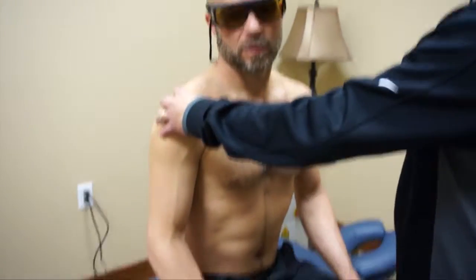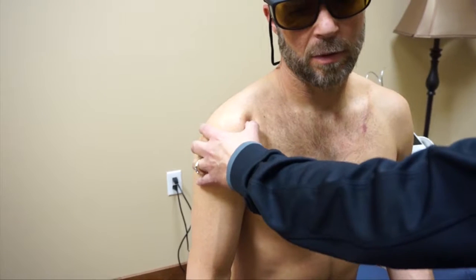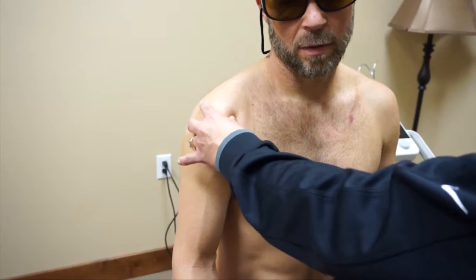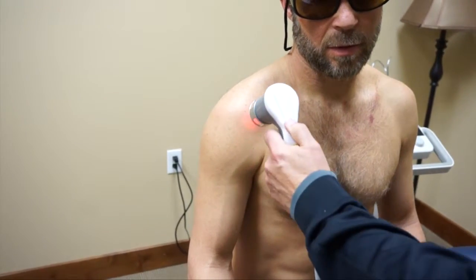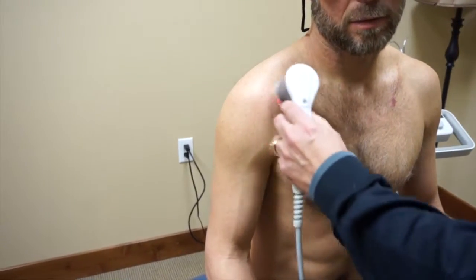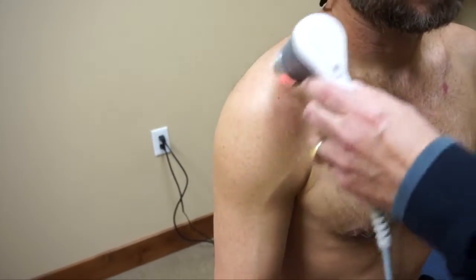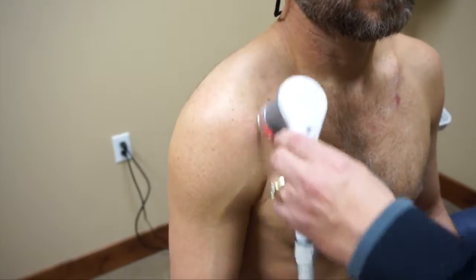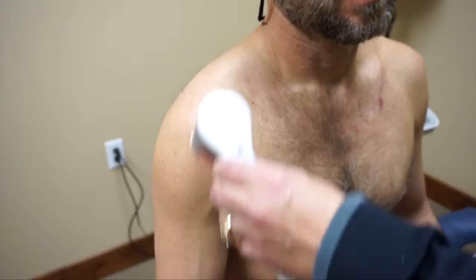I'm going to treat a shoulder impingement restricting range of motion from the right to the left. I'm going to put in 12,000 joules at 40 watts, continuous wave. You will feel this immediately and it will feel like a breath of warm air — let me know if it gets too warm. This is going in about three and a half to four inches, until it hits wavelength depth or bone, and then it's reflected away or absorbed in the bone.